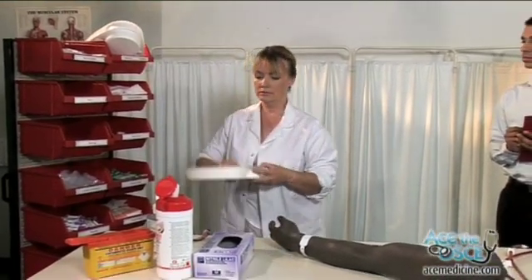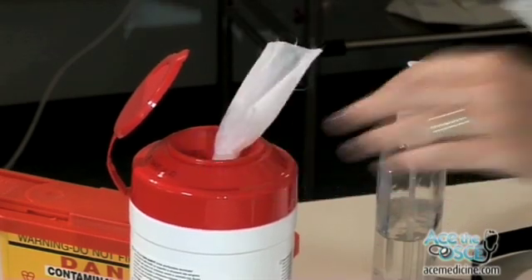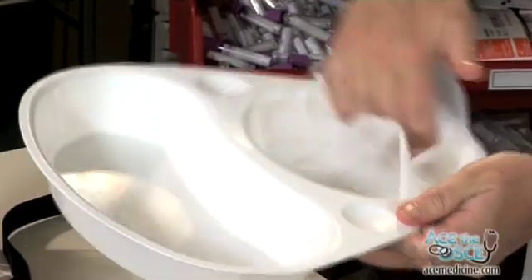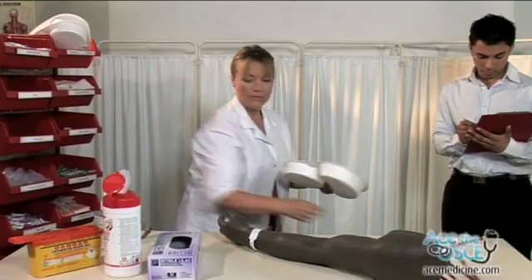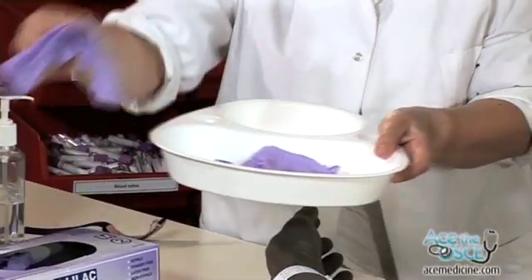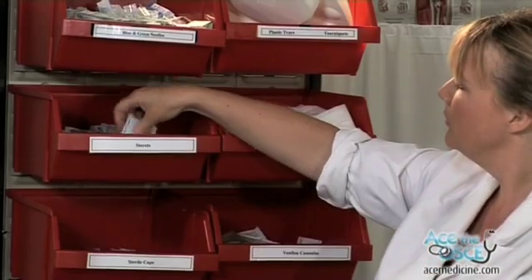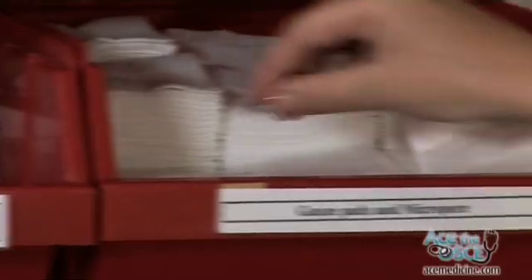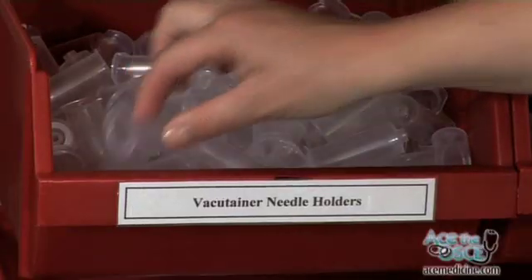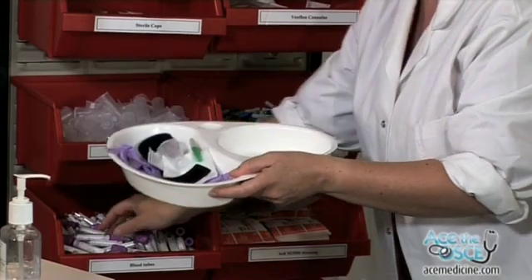Collect a clean tray. Pair of gloves. Tourniquet. Alcohol swab. Gauze. Vacutainer barrel and needle, or needle and syringe. Blood bottles.